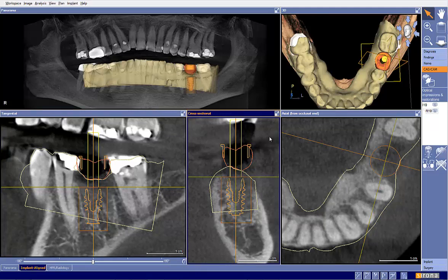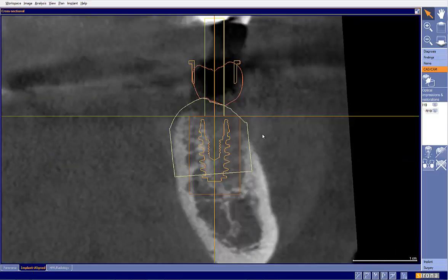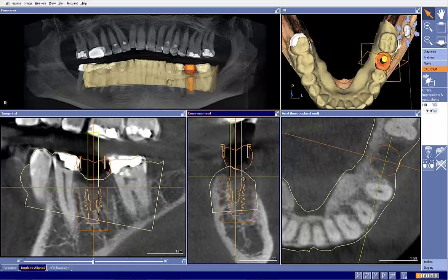I do have a question on the depth of this implant. The bone has not filled in quite well enough to know whether or not that implant is totally in tissue or not. Sorry, totally in bone. It may be in tissue if there's a little bit of resorption here. So we'll take a closer look at this as we move forward. But that's a minor question I have.